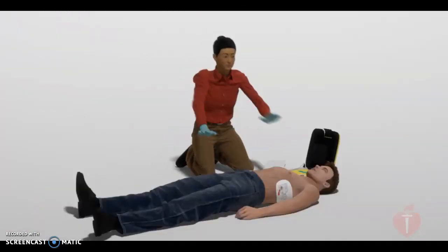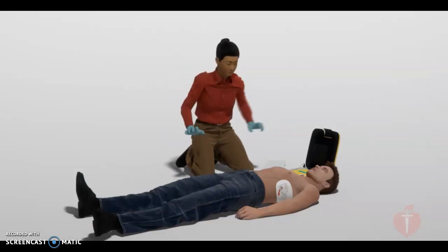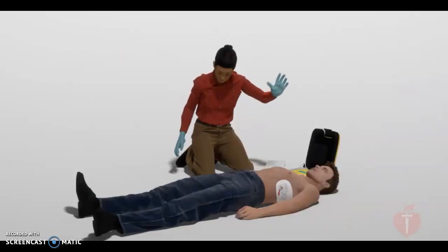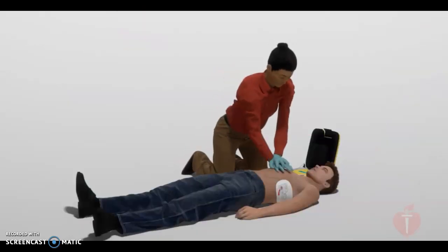Analyzing heart rhythm. Do not touch the patient. Okay, everyone stay clear. Shock advised. Charging. Stay clear of patient. Okay, everyone clear. Deliver shock now. Shock delivered. Begin CPR. Start with compressions.